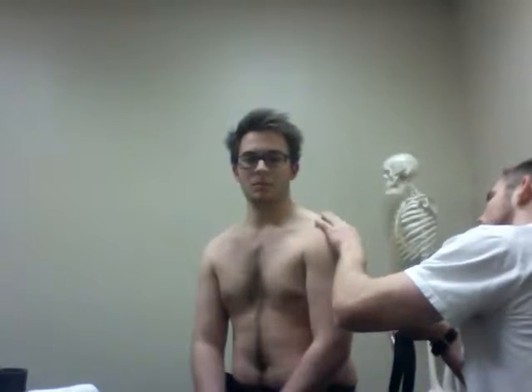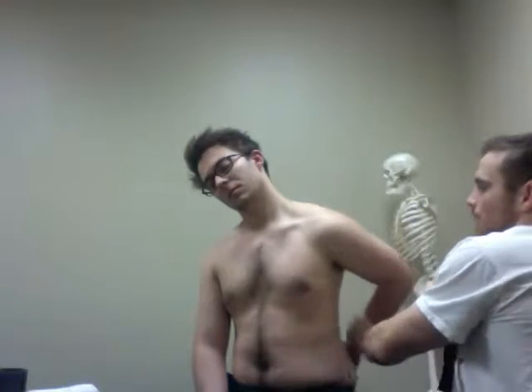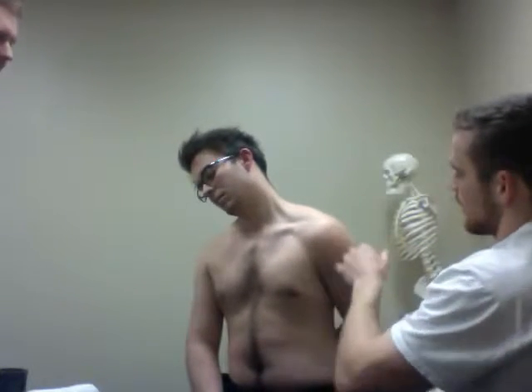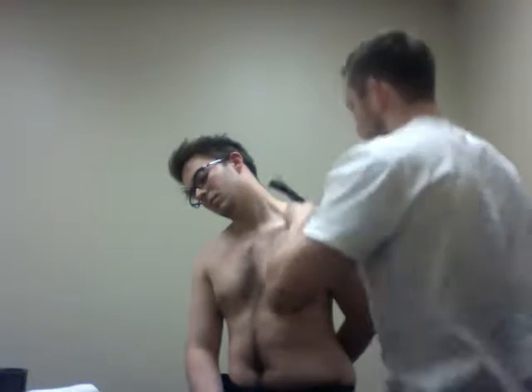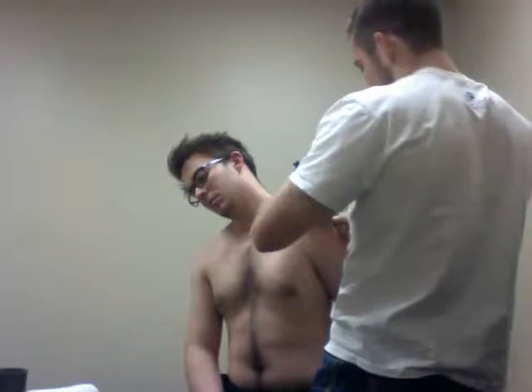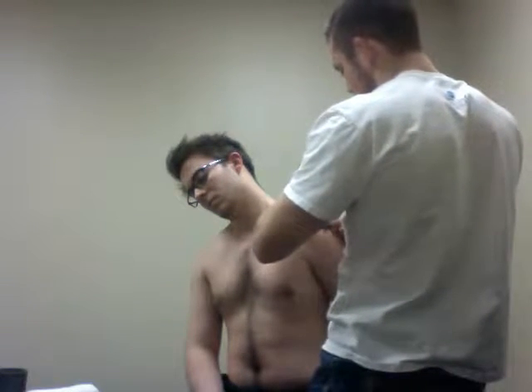The first thing I'm going to do is apply an anchor following the origin insertion of the supraspinatus muscle. I'm going to have my patient contralaterally tilt his head to the left, and he's going to put his arm behind his back to expose that muscle. We're looking at the lateral and superior aspect of the humerus. With this I'm just doing tension-off taping, so I'm not applying any stretch to this tape at this point.